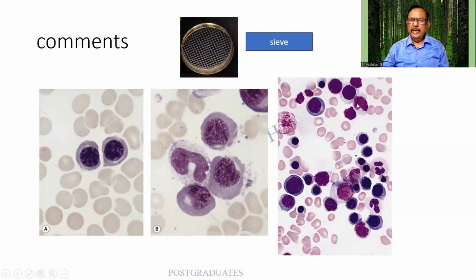And this is again a normal erythropoiesis or a normal bone marrow. I find that there are probably some cells, maybe myeloid or megaloblastoid. But then most of these cells, I'm seeing a polychromatic normoblast, and then this is probably somewhere earlier. Always identify a cell by the company it keeps.